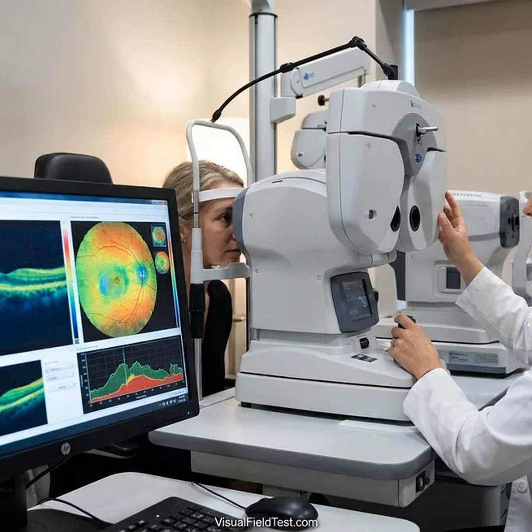Measurement variability and aging. As noted, OCT values do change slowly with age. Because OCT trend analysis is not fully age-adjusted in most devices, some thinning may just be natural. Also, each OCT machine has its own normal database. If you switch machines, the raw numbers aren't directly comparable. Finally, normal eye-to-eye variation means one healthy eye's RNFL can be naturally thinner by a few microns than the other. Doctors avoid comparing your left eye's map to your right eye's map directly. They compare each to its own age-matched norm.